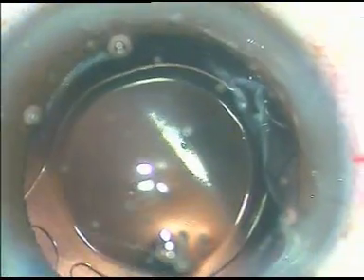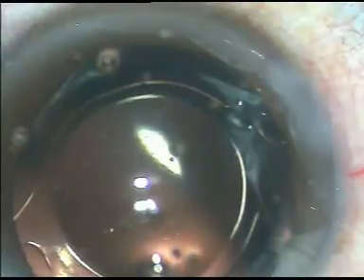A little bit of moxifloxacin is injected intracamerally. The side ports are hydrated and a final wash is given.